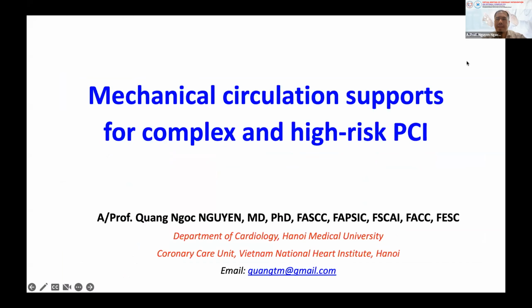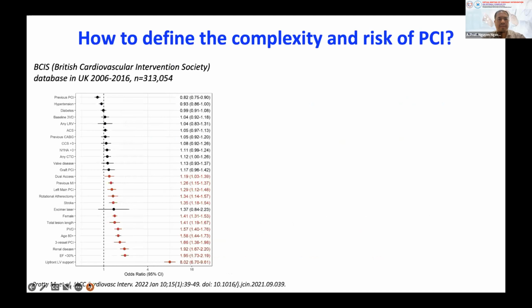Please, Professor Nguyễn Ngọc Quang. Thank you very much. In the next talk, I will just give some overview about mechanical circulatory support for complex and high-risk PCI. I think Dr. Kumar already mentioned it in his great talk. So I will just discuss a few things involving the data and what we can do for our patients.